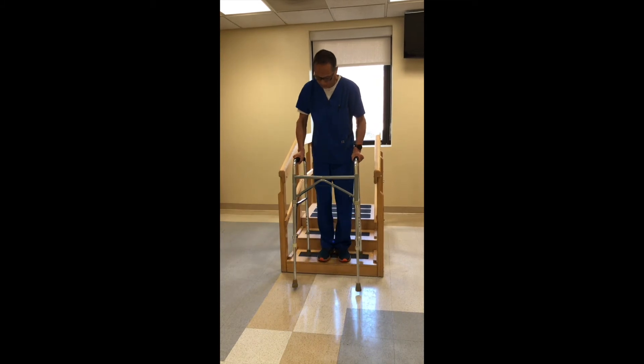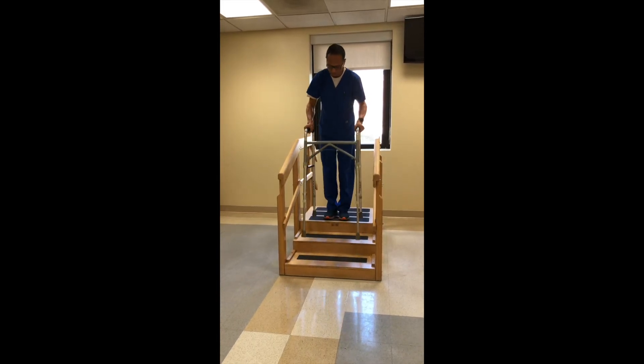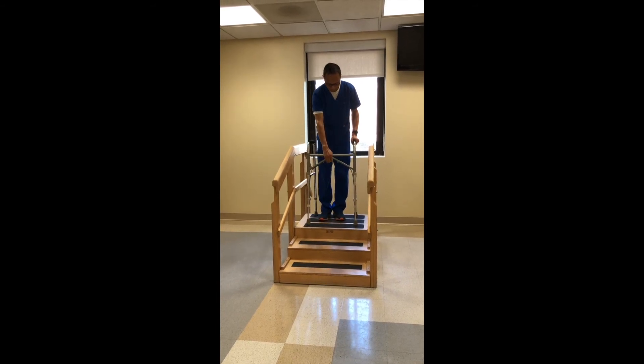Then, keeping all four points of the walker in contact with each step, you can go up the stairs backwards. Once you reach the top of the stairs, you can again reach forward, grasp the handle, and drop the front legs down to their normal height.